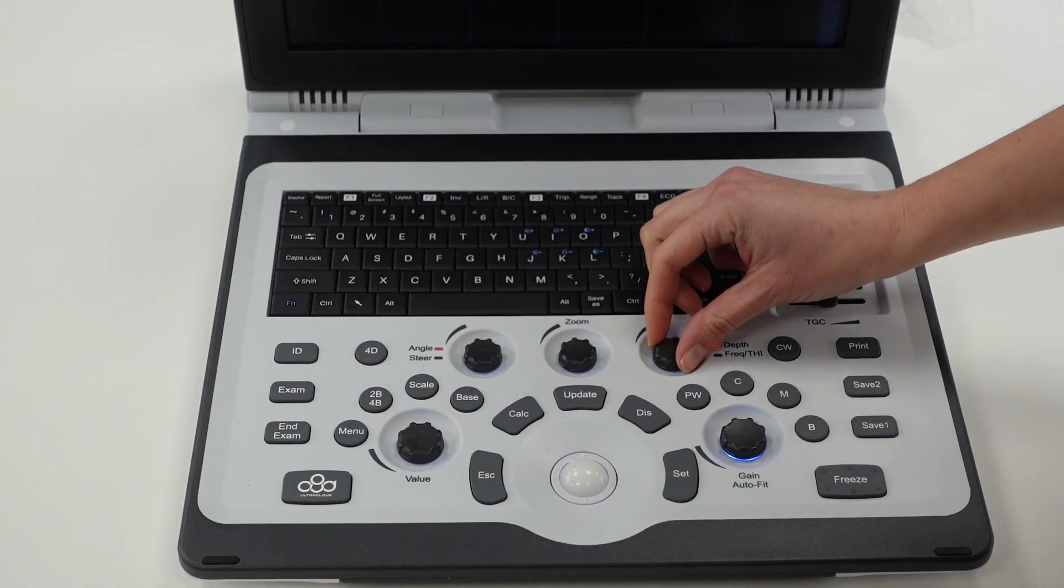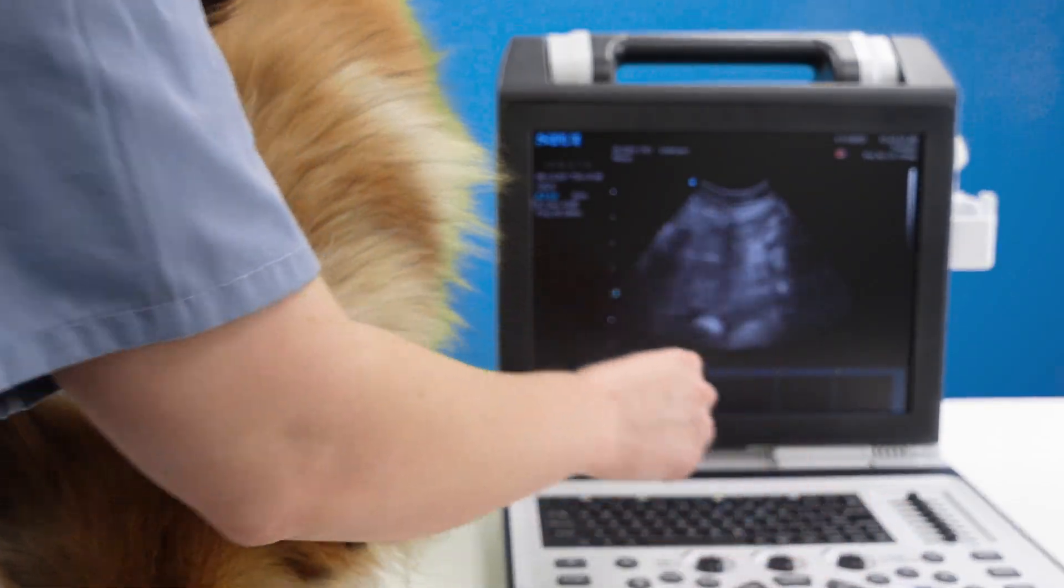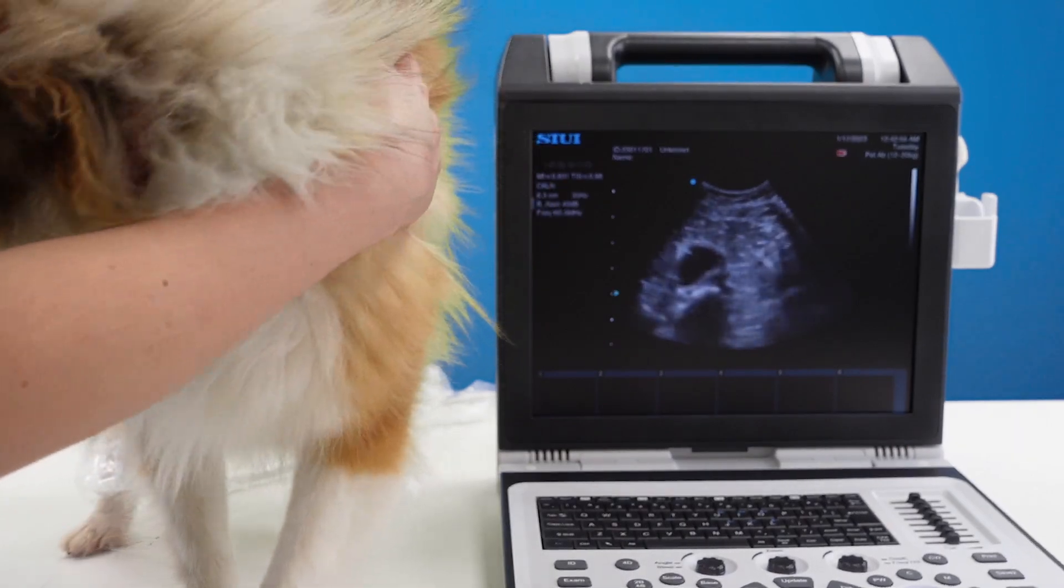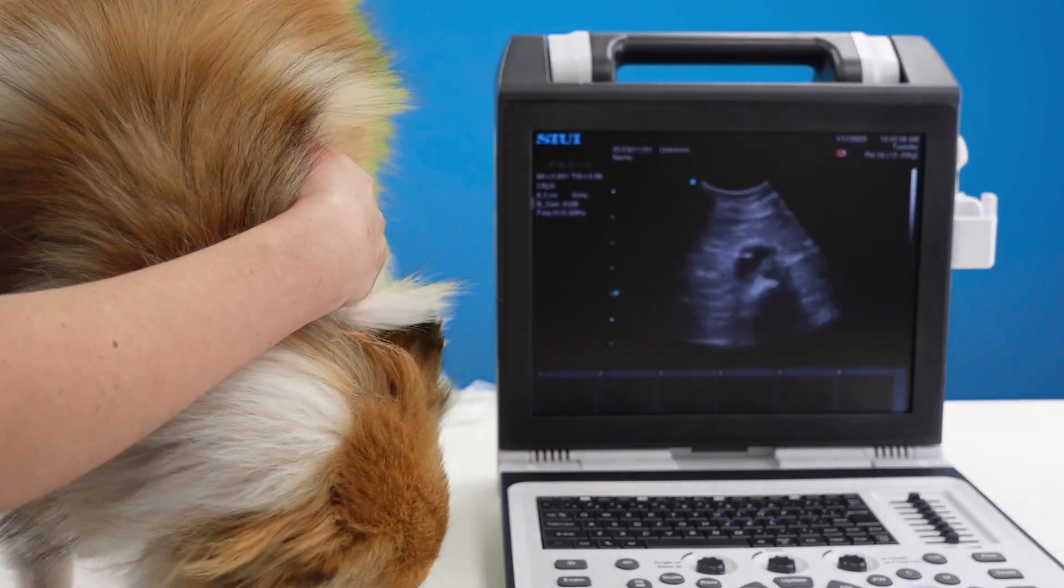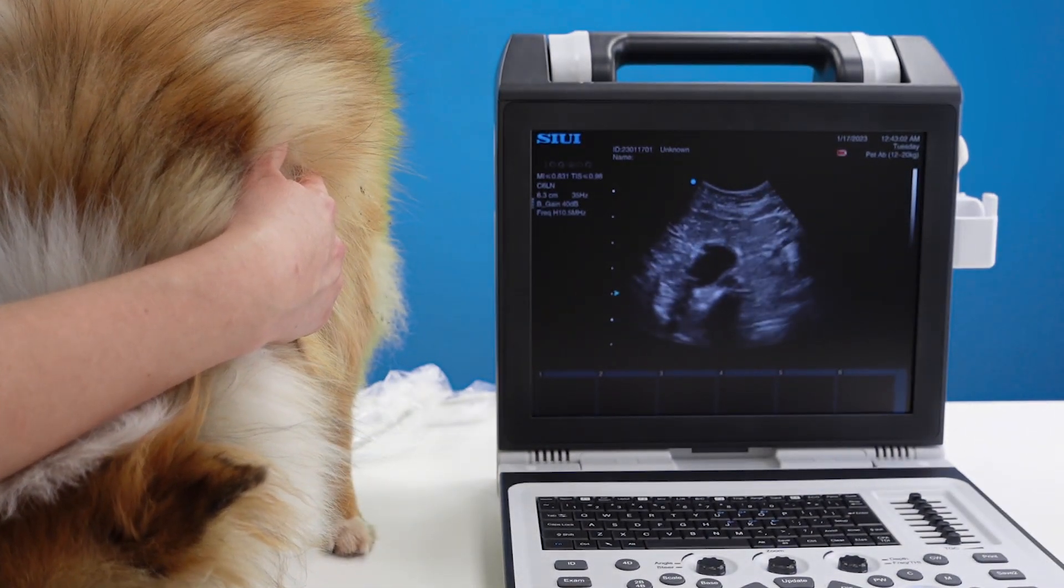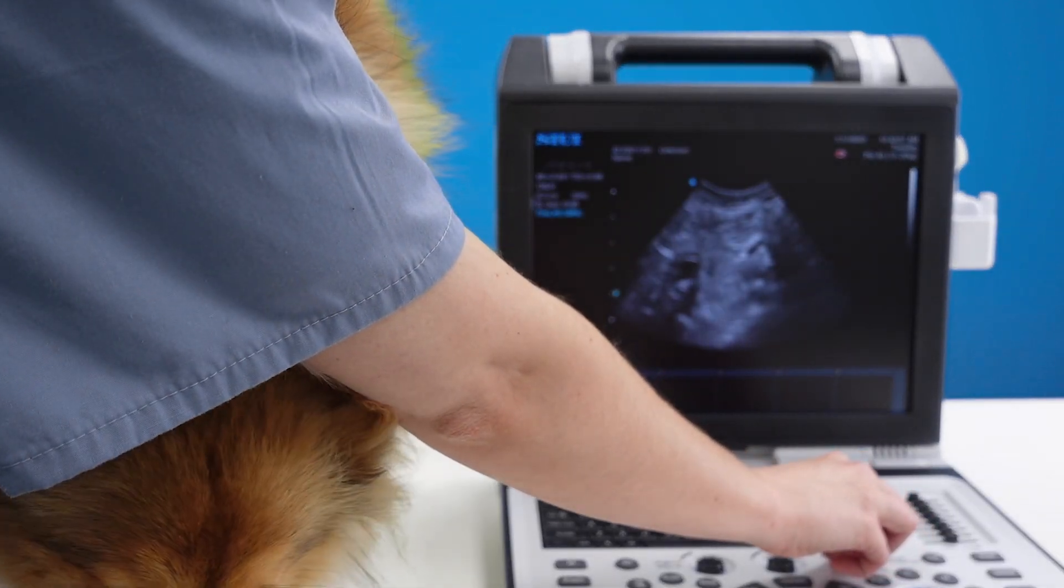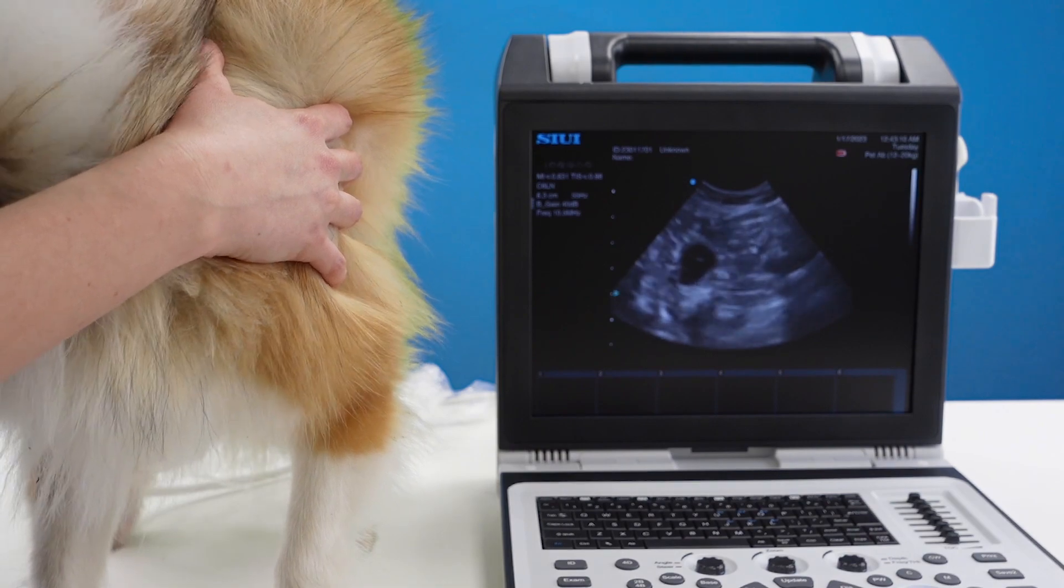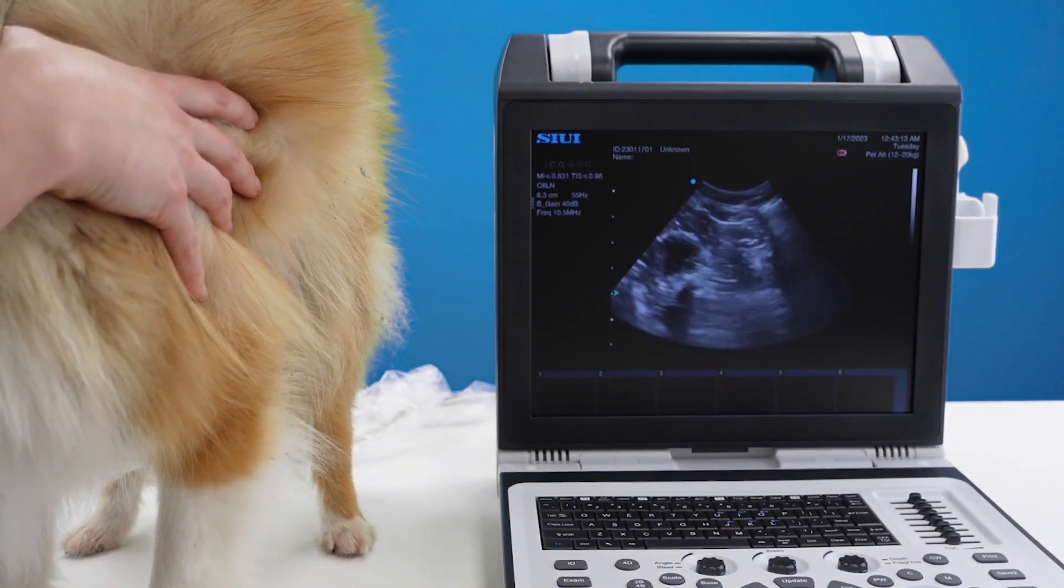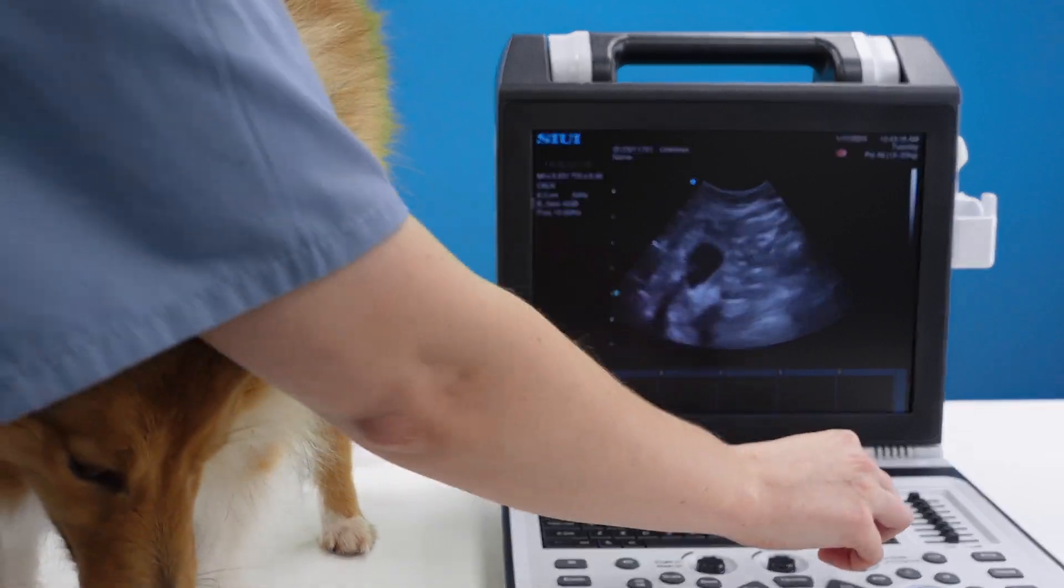Depth is adjusted here. If you press it once it will now turn to frequency. So I'm increasing my frequency up to 10.5 megahertz in my harmonics and now I've turned harmonics off. So with this machine there's not a separate THI button. It's all on the frequency button.